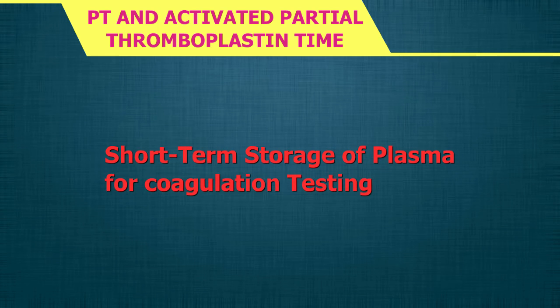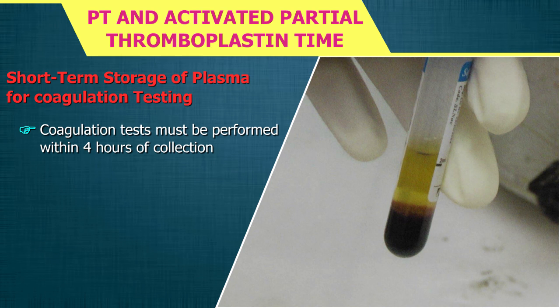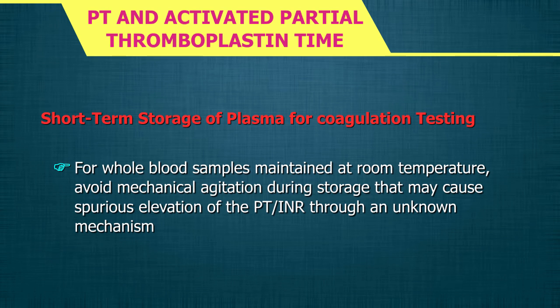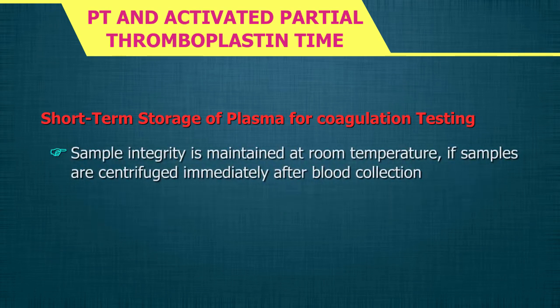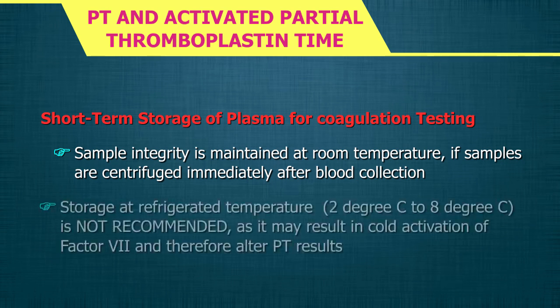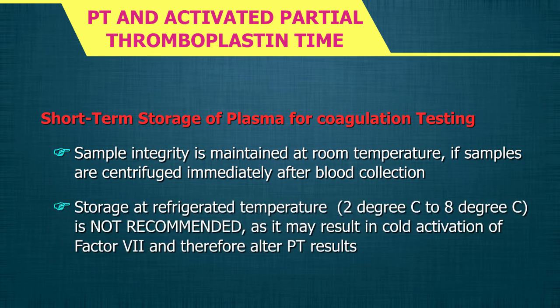Coagulation tests must be performed within 4 hours of collection. If a longer delay is expected, plasma should be made platelet-free and kept frozen: at −20°C for up to 1 week, and at −80°C for up to 1 year. For whole blood samples maintained at room temperature, avoid mechanical agitation during storage, as that may cause spurious elevation of PT or INR. Storage at refrigerated temperature (2–8°C) is not recommended, as it may result in cold activation of factor 7 and alter PT results.